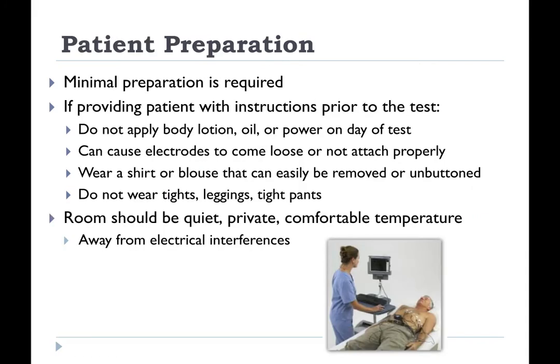Minimal preparation is required. If you get the chance to provide the patient with instructions prior to the test, before they're coming in, so maybe they call and say, I need an EKG for a pre-op clearance, or, this doctor ordered one, when can I come for it? If you schedule them an appointment for the next day, maybe, you would let them know not to apply body lotion, oil, or powder on the day of the test, because it can cause the electrodes to come loose, or they won't even stick and attach properly.